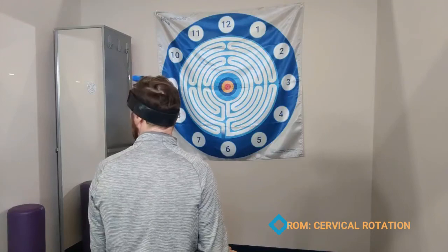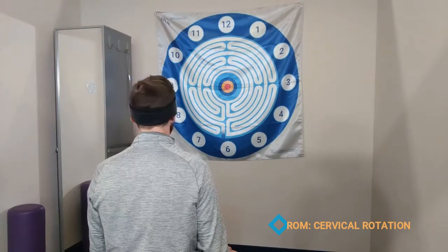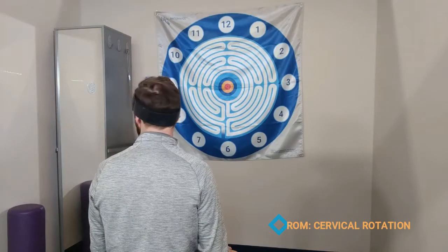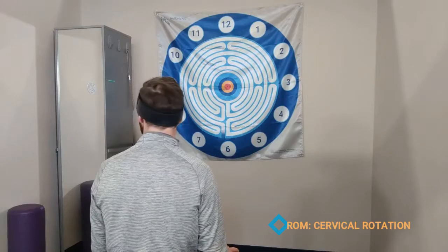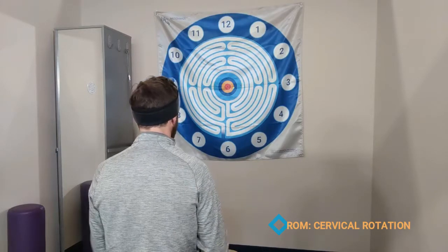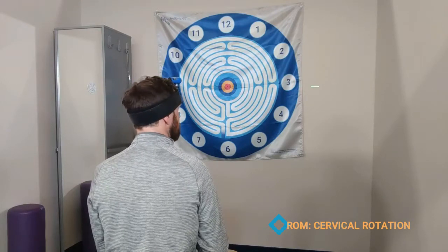Now this is obviously going to track well beyond the flag here, but even in this position you can pick a little target and put a sticky pad on a wall, hold their trunk still, and visualize if they're limited in one direction but not the other.